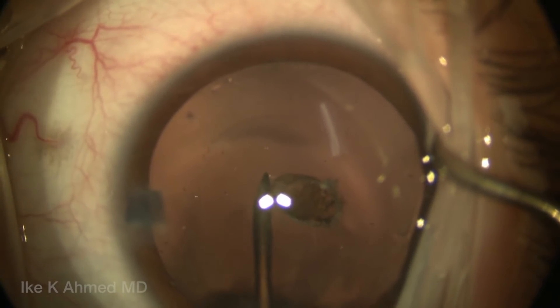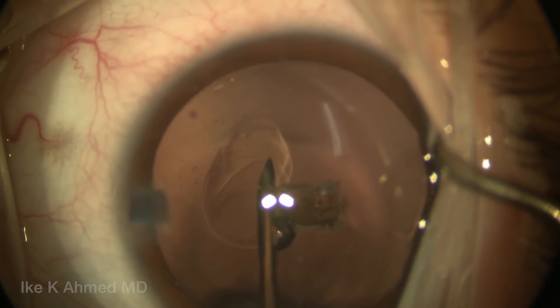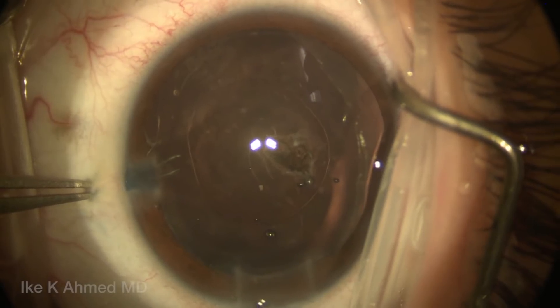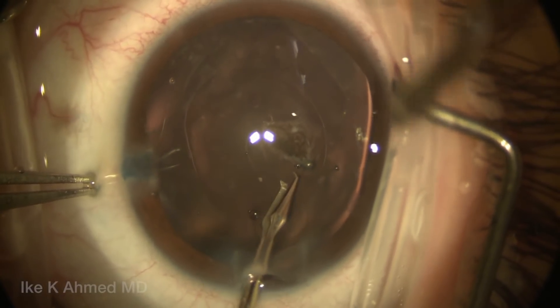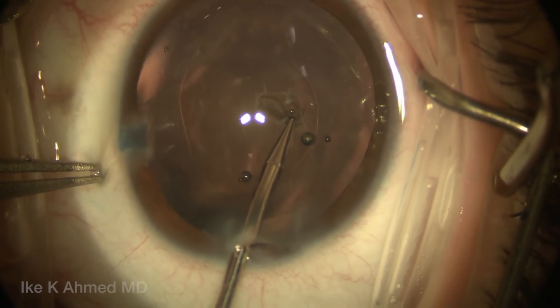A 27-gauge sharp needle is used to incise the central posterior capsule after injection of viscoelastic in the AC, as we saw earlier. Then we're going to inject some dispersive viscoelastic to separate and keep the posterior capsule away from the anterior hyaloid, injecting that into Berger's space.